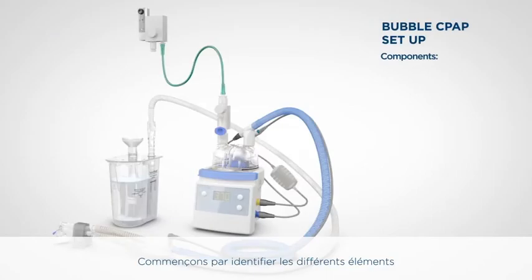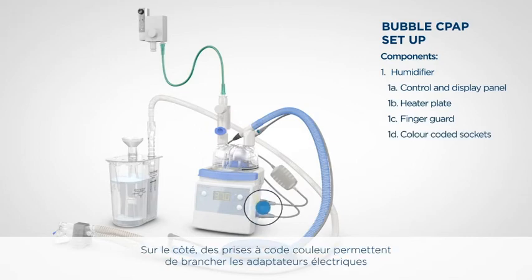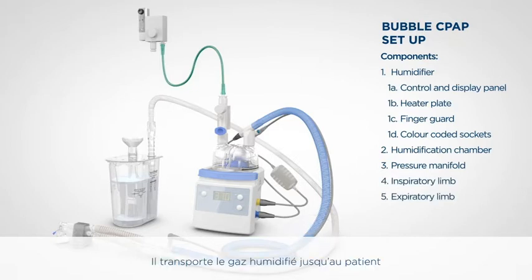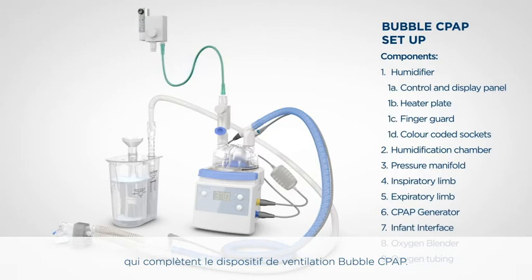Let's start by identifying the components of the F&P Bubble CPAP delivery system. This is the humidifier. It has a control and display panel at the front, a heater plate and finger guard on top, and colour-coded sockets to connect electrical adapters and sensing probes on the side. This is the humidification chamber that holds water. It is filled from a rigid or flexible water bag through the water feed tube. This is the pressure manifold, designed to limit the pressure to 17 centimetres of water at 8 litres per minute. This is the breathing circuit. It carries humidified gas to the patient and also carries the expired gas back to the CPAP generator. This is the CPAP generator — it maintains mean CPAP pressure. You can also see the oxygen blender and oxygen tubing used to complete the Bubble CPAP delivery system.